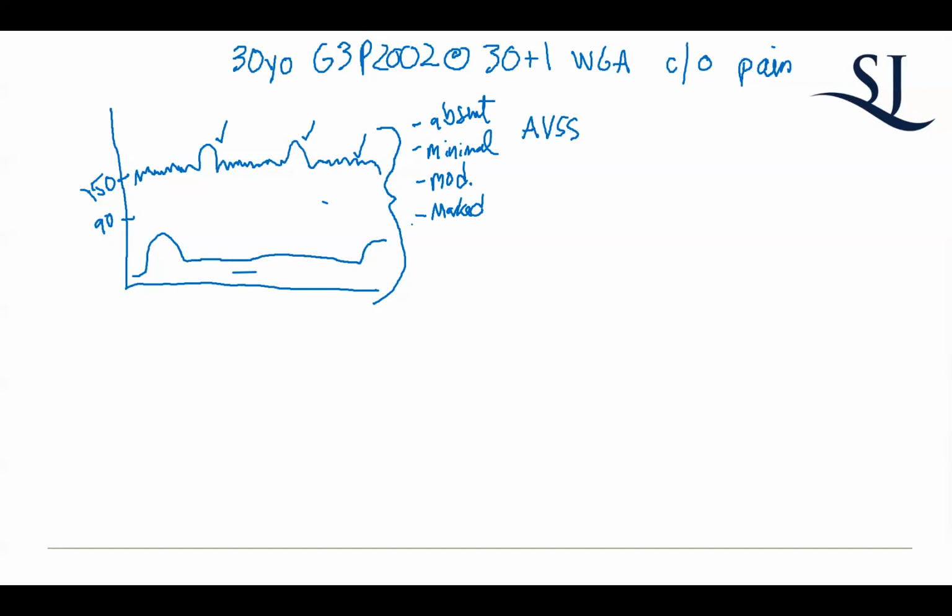Well, actually, accelerations are a good thing. You want to see this. Just kidding. Remember, we had our conversation about non-stress tests, right? NST. And what do you need for an NST? You need these, right? You need your accelerations. And if you're in labor, you don't necessarily need accelerations to maintain a category 1. But for non-stress testing, you do need accelerations. So fluctuations like that are a good thing.